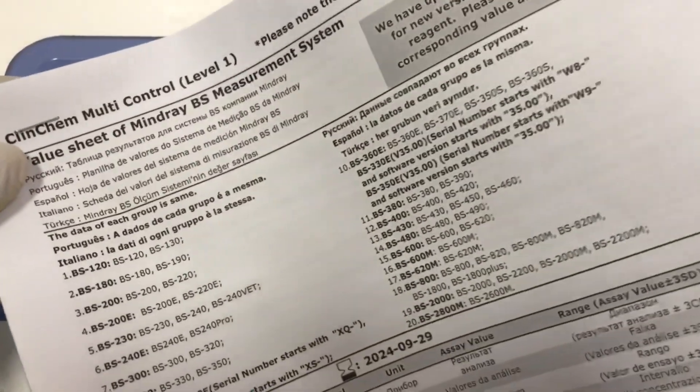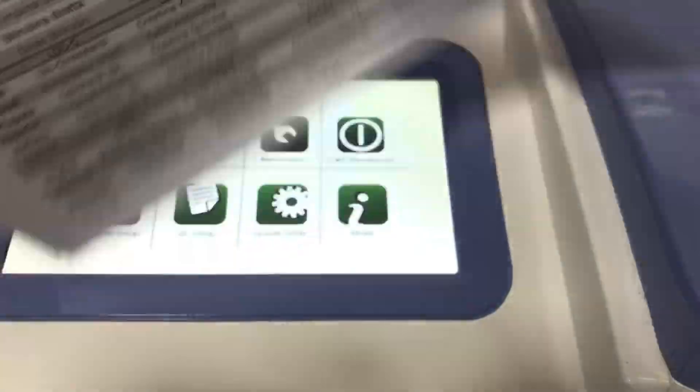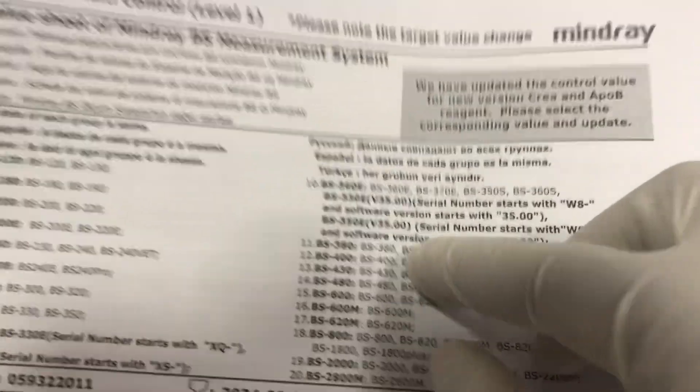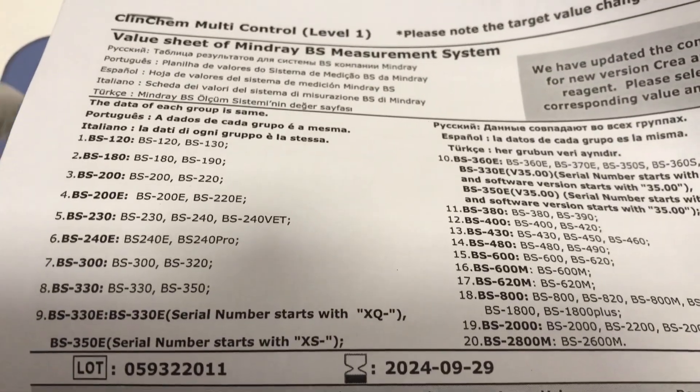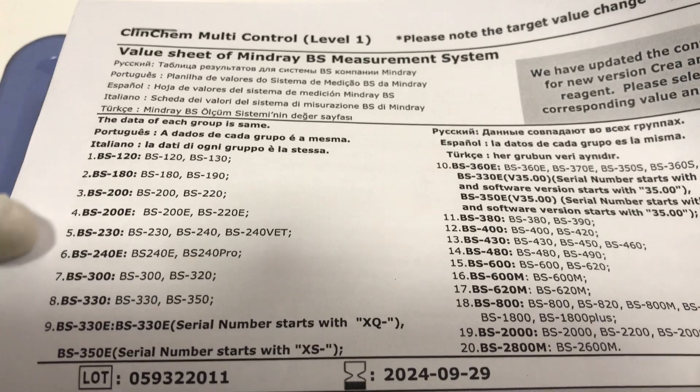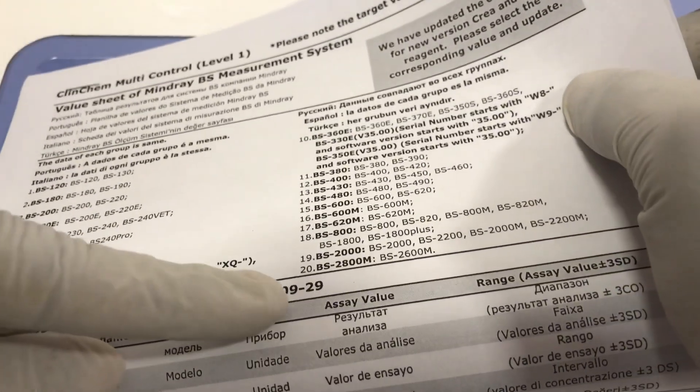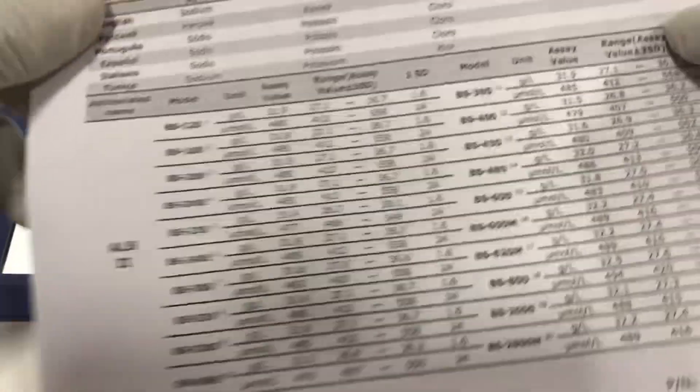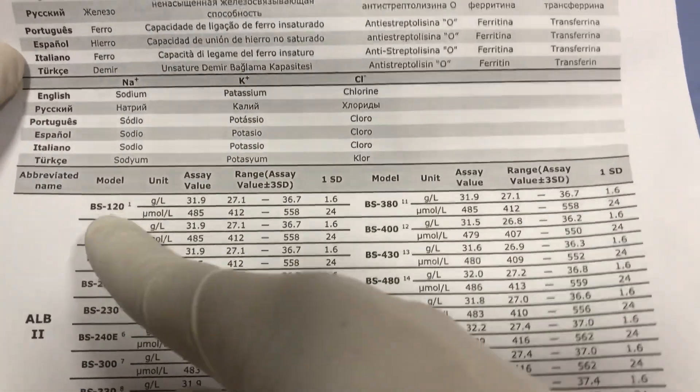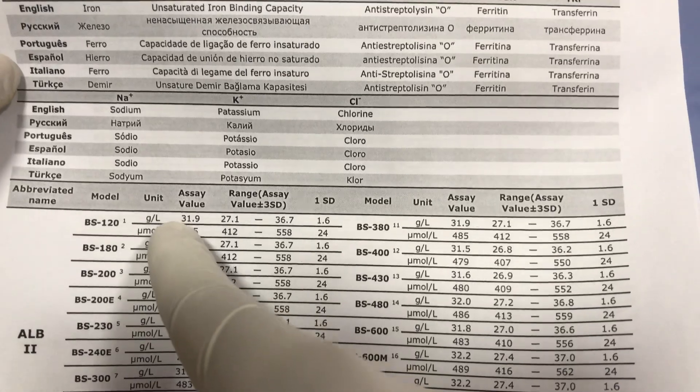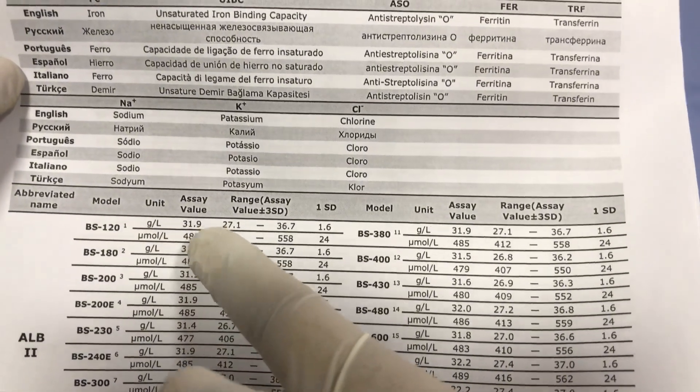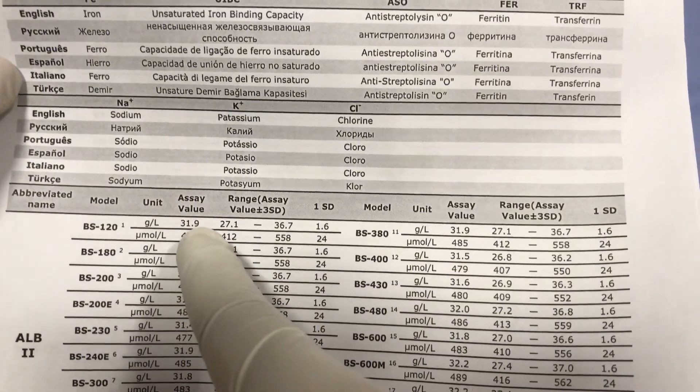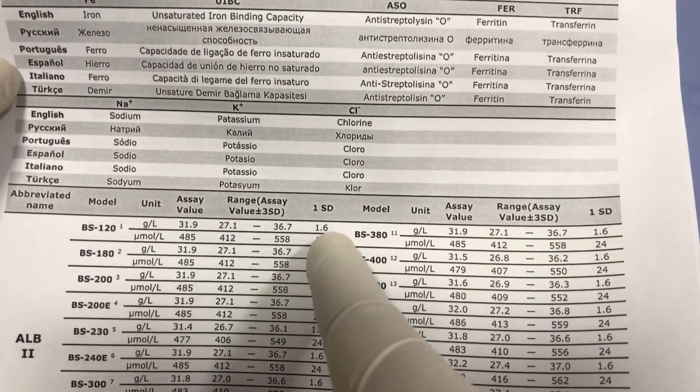This is one from Mindray. When you buy the reagent you can download this from online. It has all the models of the Mindray machine here. Number one is the BS-120, then it comes down to the most current one which is the BS-2800M. We have each of the analytes that you are going to use. Let me show you this is for albumin. BS-120 albumin in grams per liter - the expected value for this sample was 31.9 and then the standard deviation is 1.6.